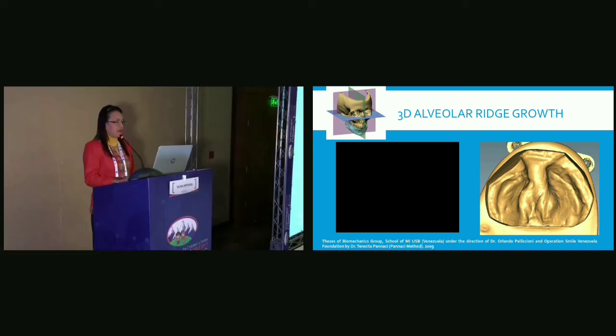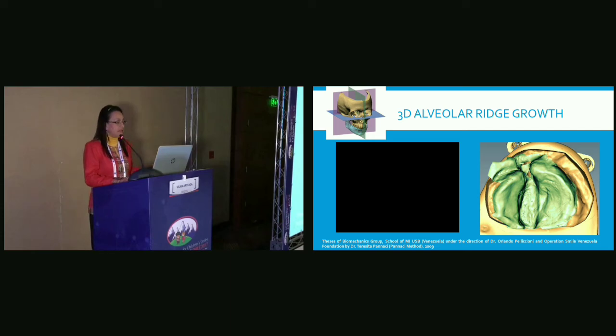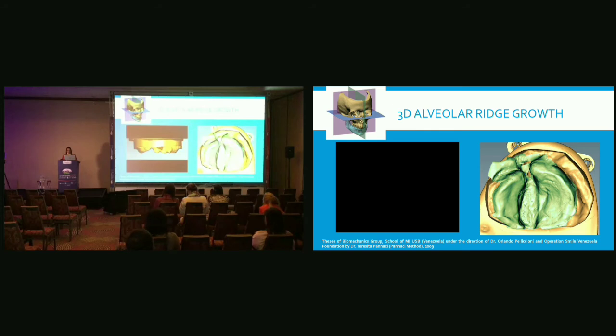So now we can see in the pictures how the bone is covering and closing the gap, with no detriment to the transverse growth of the maxilla. This is how the patient was growing, like this, and the patient is ready to be sent for a palatoplasty.